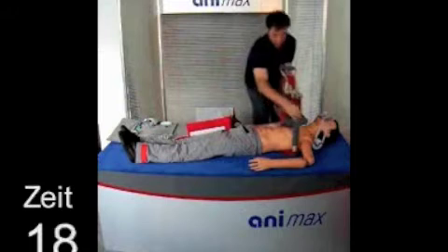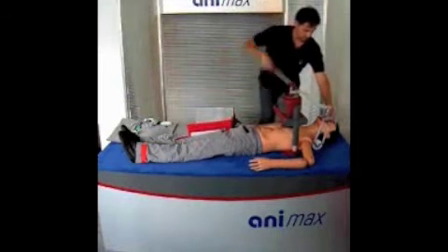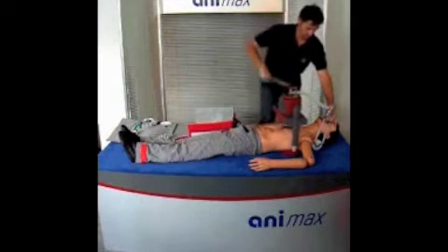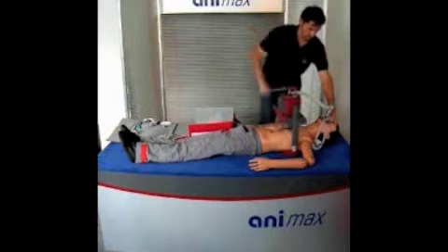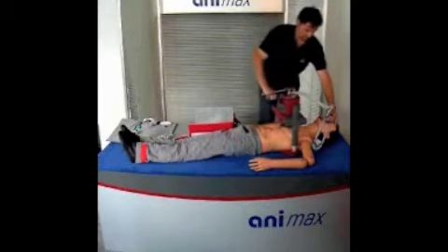While the cardiac massage is already taking place, you put the patient valve into the ventilation mask. Animax operates according to the current guidelines, alternating 30 cardiac massages and 2 ventilations. The pressure depth and the ventilation volume adjust themselves depending on the patient's chest size.